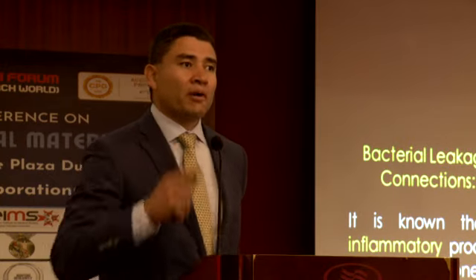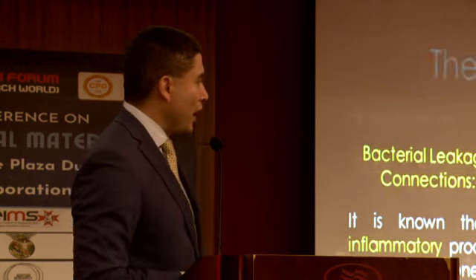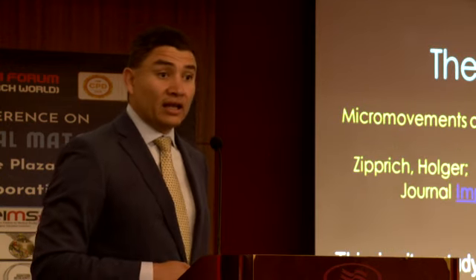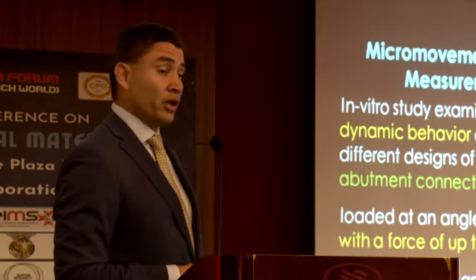There's another problem around implants, which is the implant design, the micro gap, right? What happens with the micro gap? Well, it leads to micro movement. What is micro gap and micro movement? Well, I'm going to explain it to you in 2 minutes.